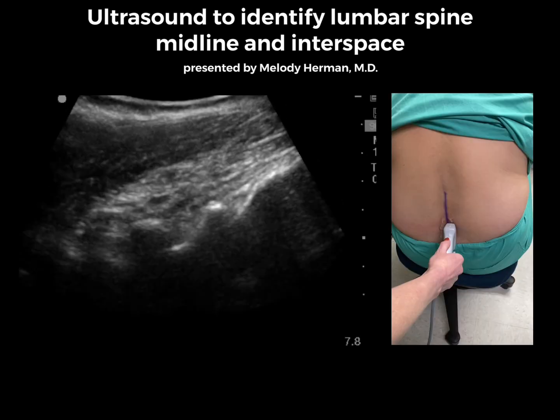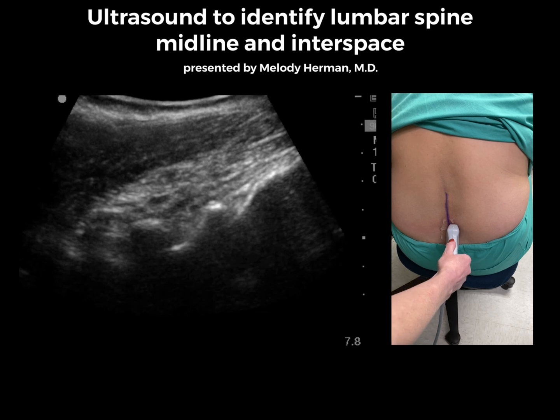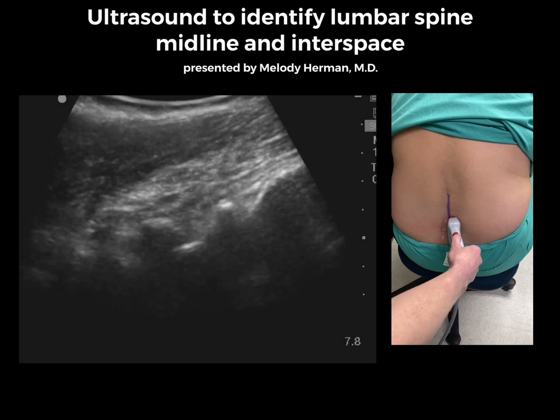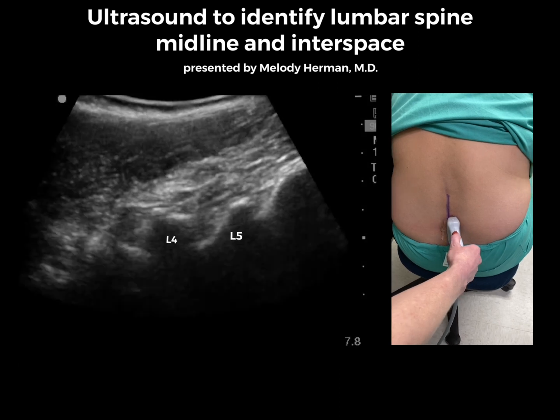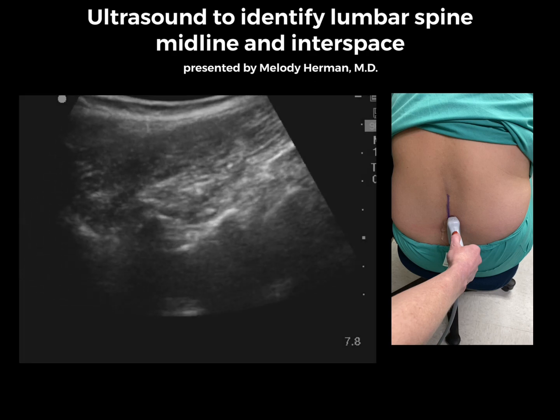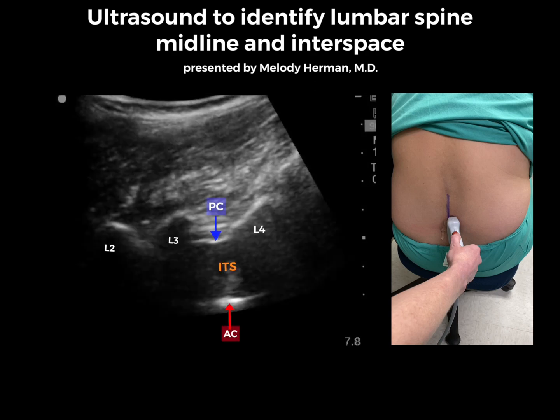To identify the interspace, place the probe in the sagittal orientation just lateral to midline with a slight medial tilt to see into the spinal canal. Here we see the bright white stripe of the sacrum caudad, followed by the triangular-shaped lamina cephalad. As we move the probe cephalad, we can identify each lamina and the exact interspace where we would like to place our neuraxial anesthetic.